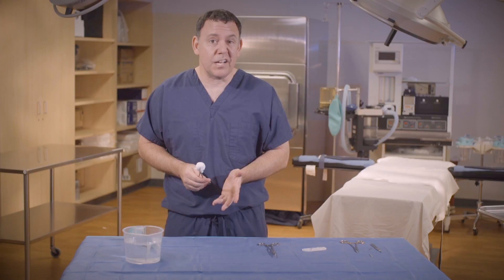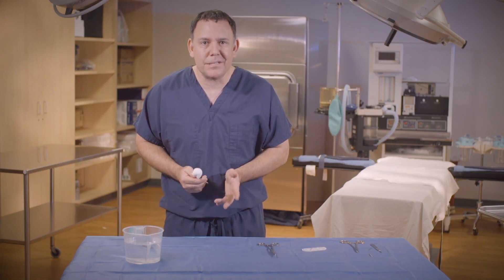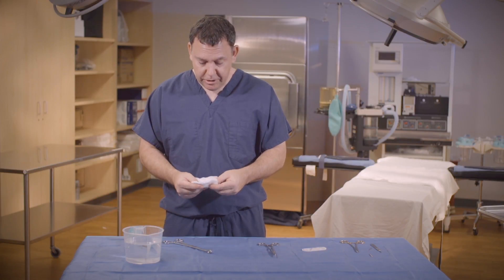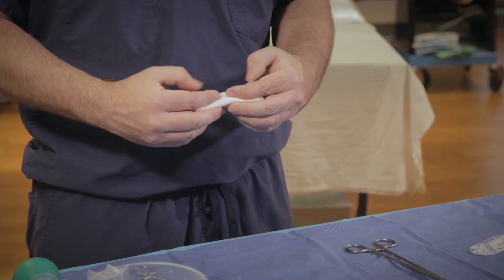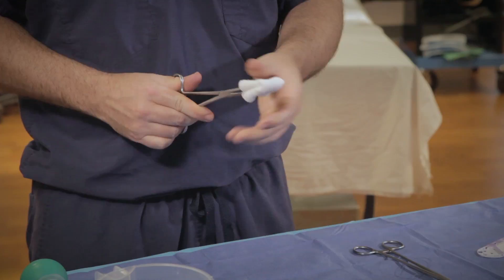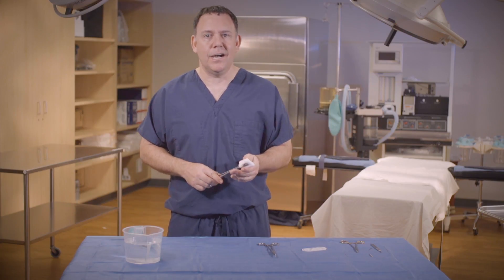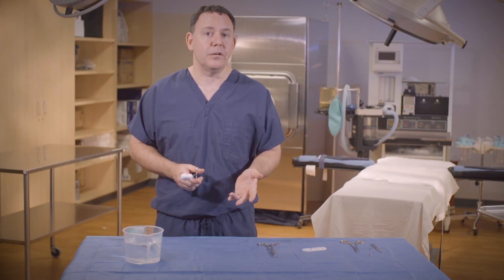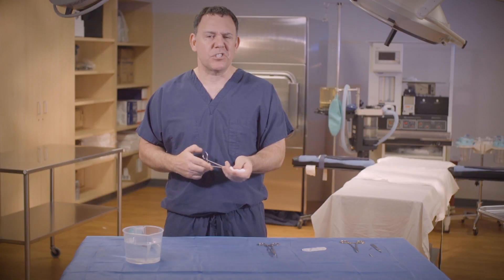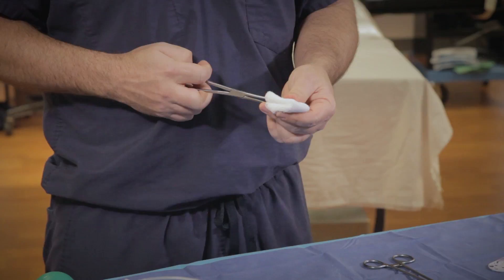Now some surgical techs think the second method is way faster and tighter, but I've never really timed it. Basically this method is you fold the sponge into thirds, fold it in half, and then load it onto your sponge forceps that way. I don't know which way is faster, but I do like the first method better because all of the metal is completely covered. And if the surgeon is one of those surgeons that really likes to dissect, I like having all the metal of the sponge forceps covered.